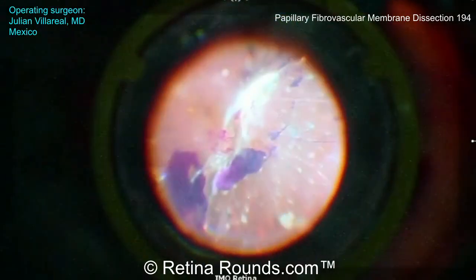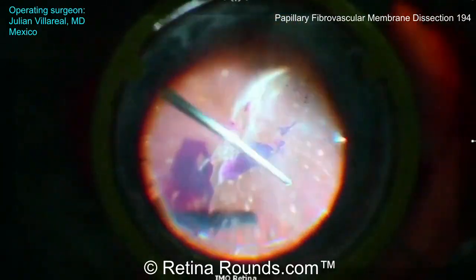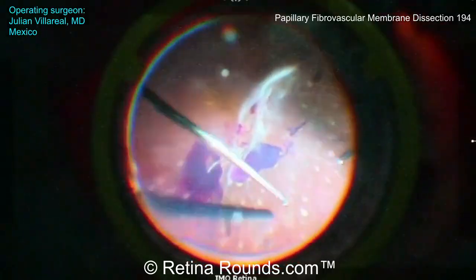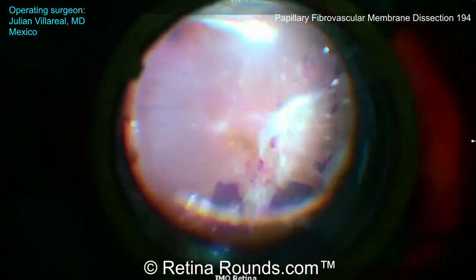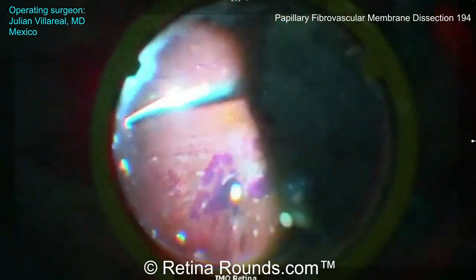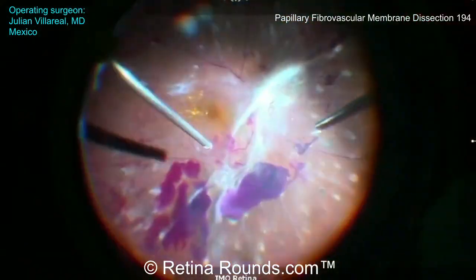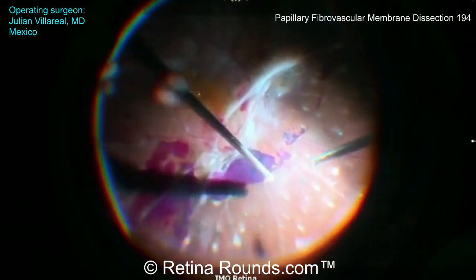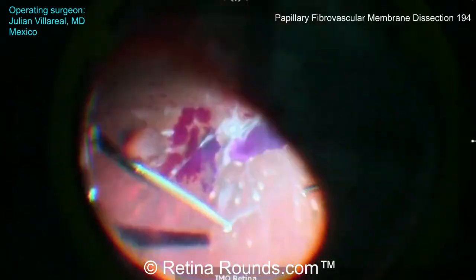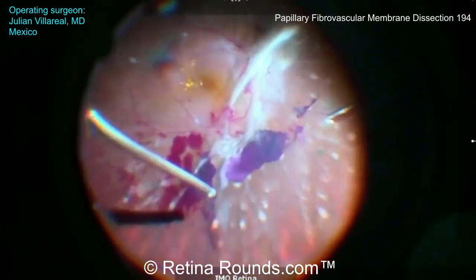The surgical video has been sped up so that we can get through the entire case. You can see here that we're starting with the core vitrectomy, and you can see Dr. Villareal is trimming back the vitreous to the midperiphery or just anterior to it. You can appreciate here that there is a fibrovascular membrane over the optic nerve with associated peripapillary traction, and there also appears to be a sheet of posterior hyaloid that's still adherent to the retina.